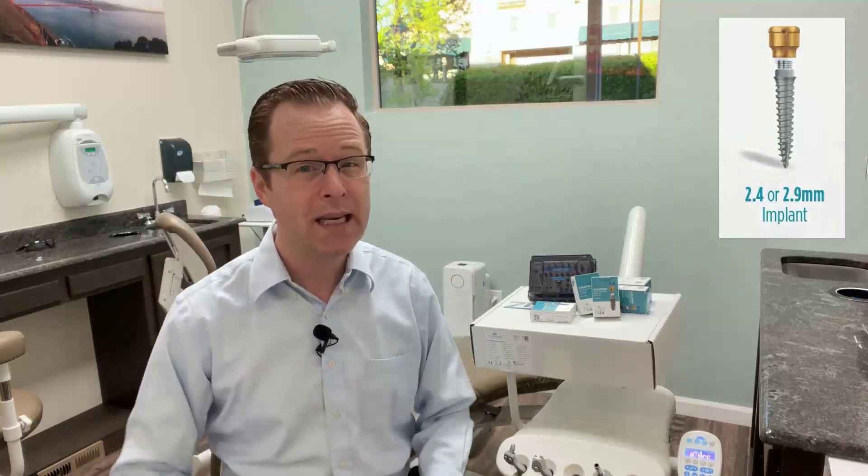Many of us, including myself, are very familiar with the Locator Overdenture Implant System. It's been a workhorse in my clinical practice for the past several years. The 2.4 and 2.9 millimeter diameter Lodi System, often called a mini implant — which I tend to call a narrow diameter implant because it's meant for narrow ridges — has been a workhorse in those really tight clinical spaces where really no other implant would work.